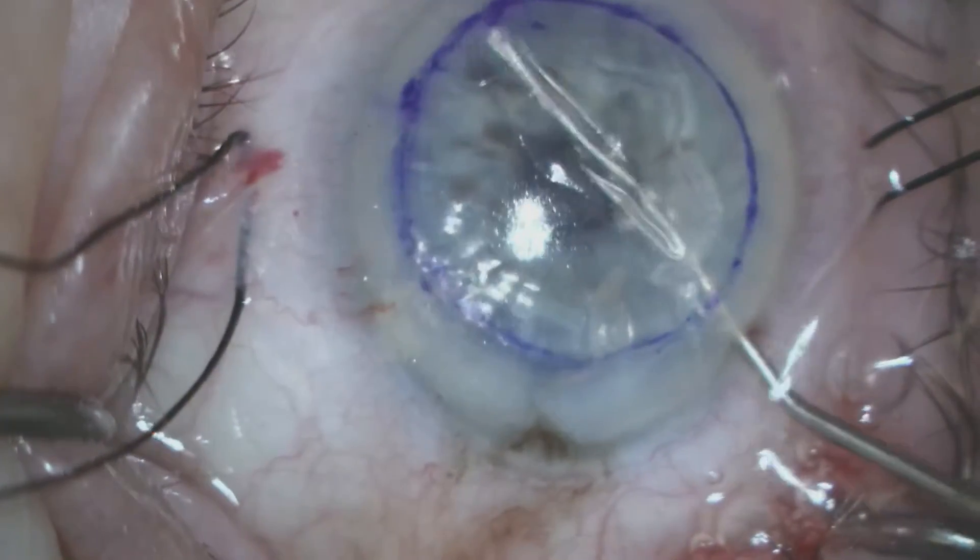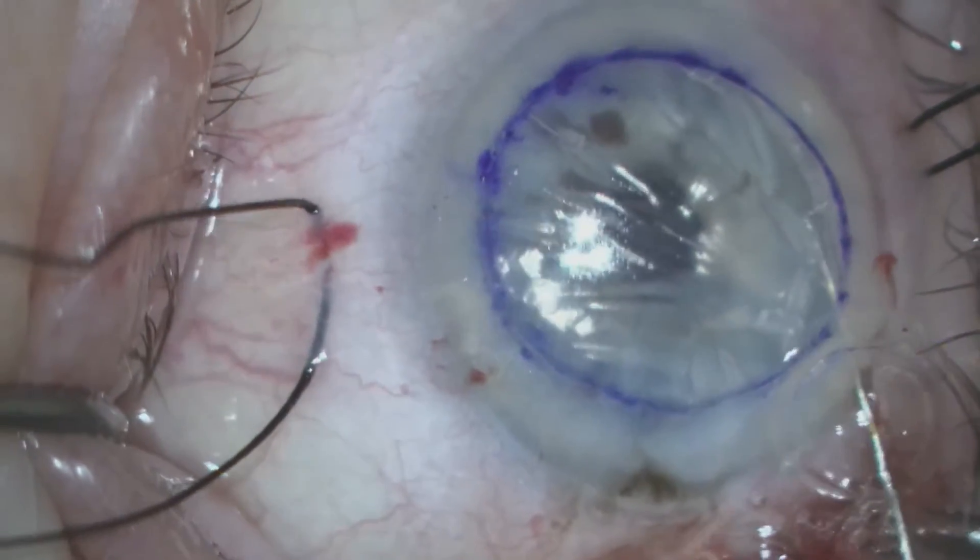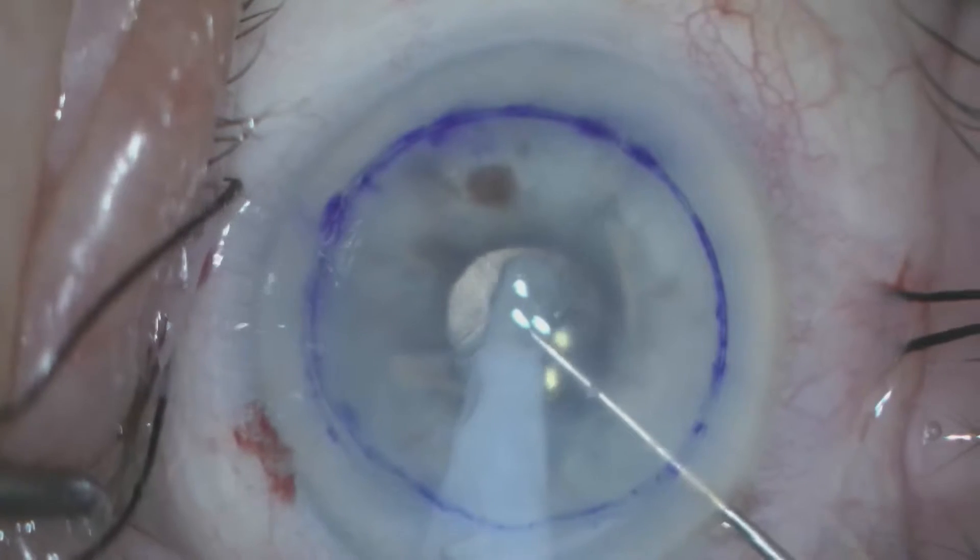We then use a reverse Sinski hook to score the endothelium in the area that we intend to remove it from within the eye.